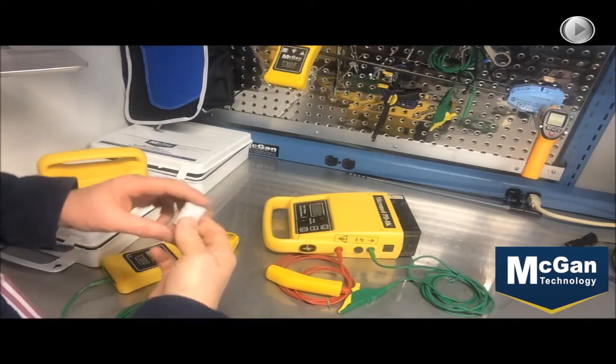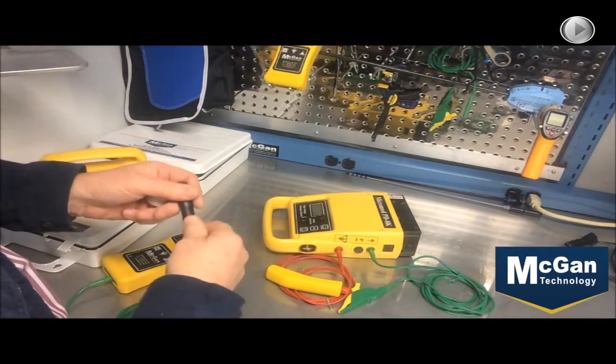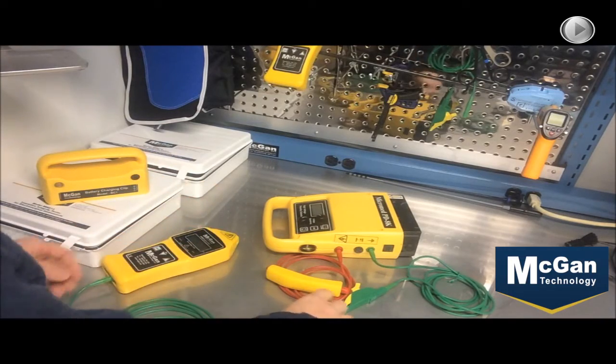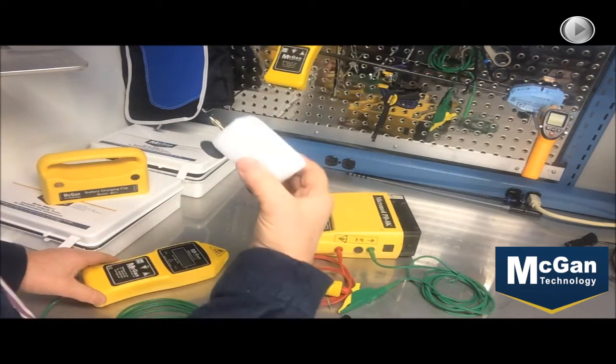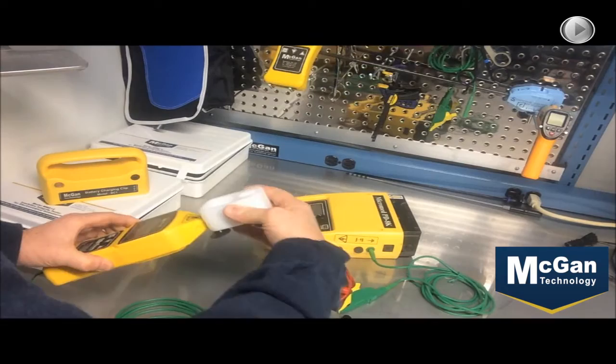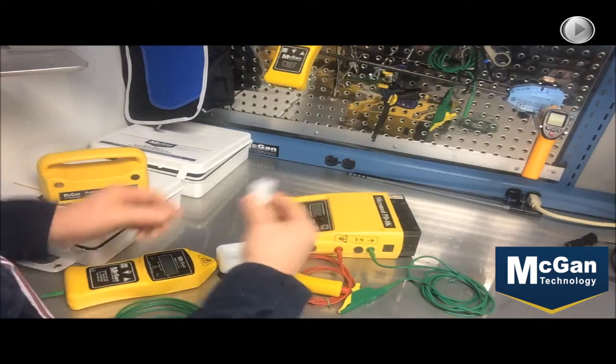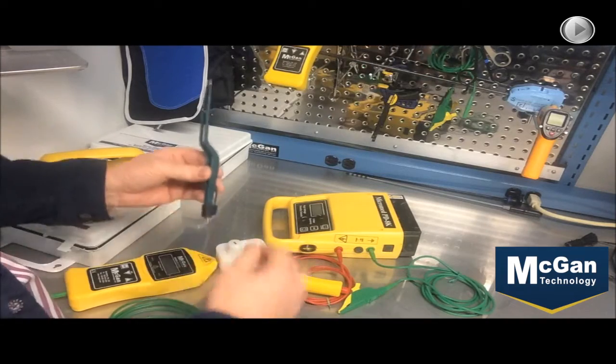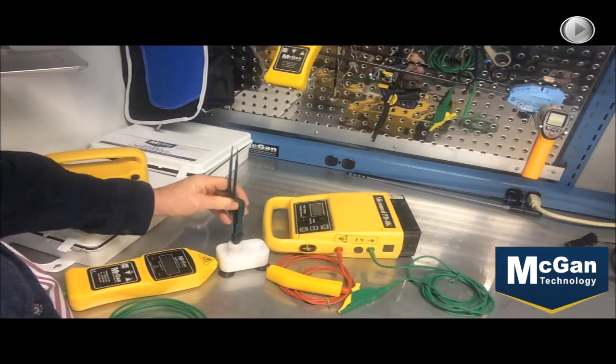Today we're going to show you how to use the new bipolar fixture along with the adapter that comes with it. First you start out with the saddle, which hooks into the 513 product. The fixture fits inside the saddle, which in turn accommodates the bipolar instrument.